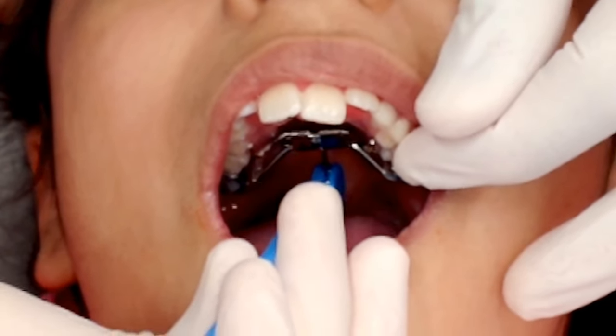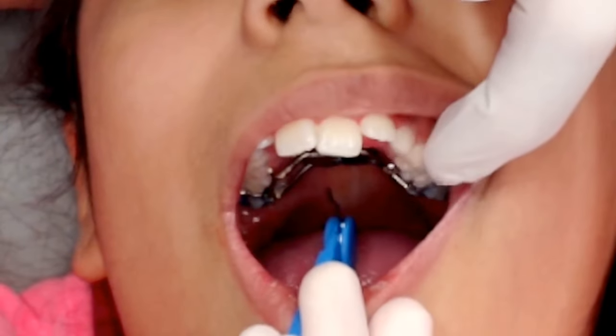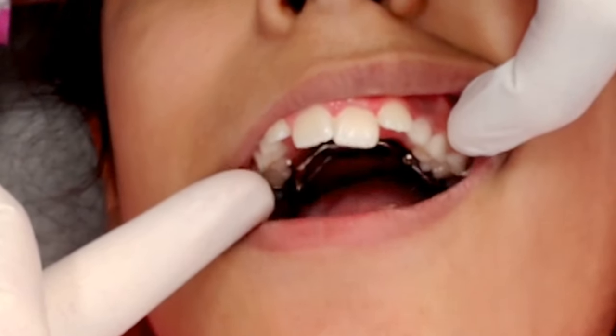And then once we're done, you should feel resistance. Then we're going to slowly pop the key out so we don't unwind the turn. And that's it.